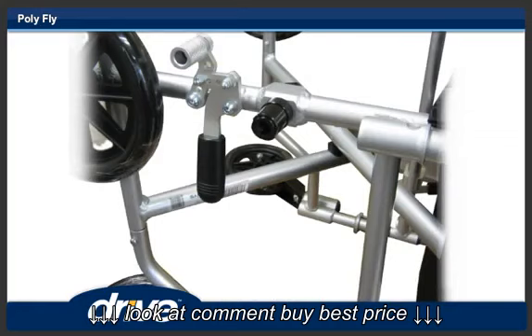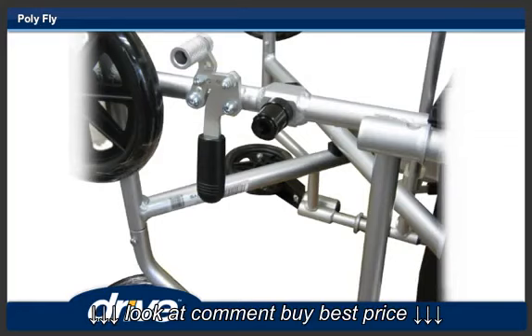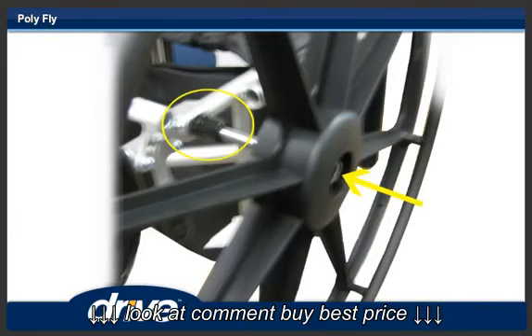Step 16. Turn the chair on its front side. Step 17. Depress the quick-release button and insert the 24-inch wheel into the axle sleeve on the rear of the Polyfly.